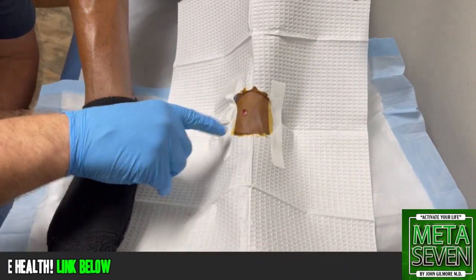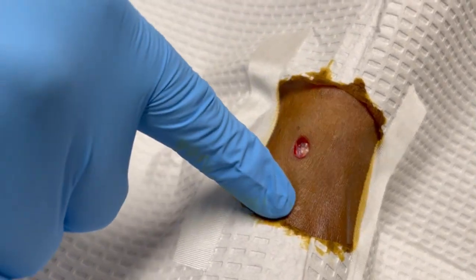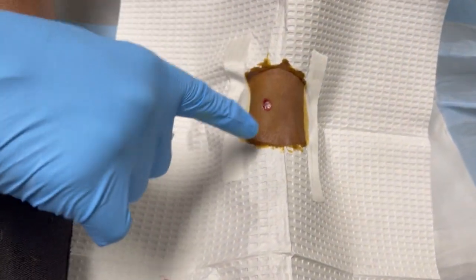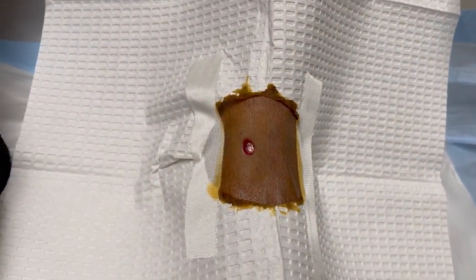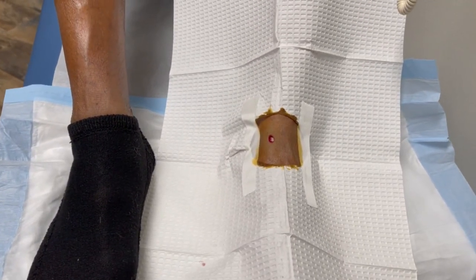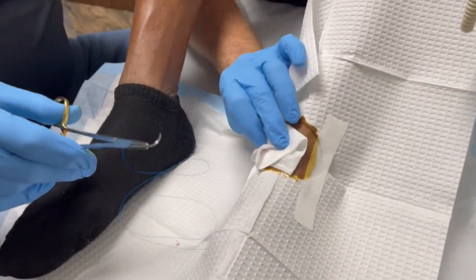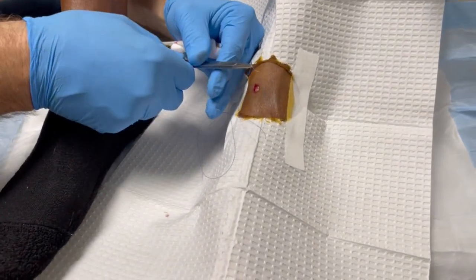It's completely gone, and that's what we wanted to be sure of — that we don't have any residual lesion on the edges. It's all completely gone. So we're going to put a stitch in now. You want to leave the stitch in about seven days, okay? The reason is this is very close to the ankle, and we don't want it to break open. You can remove it yourself or come back and we'll remove it — easy with small scissors or clippers. You clip it first, then pull it out with tweezers.